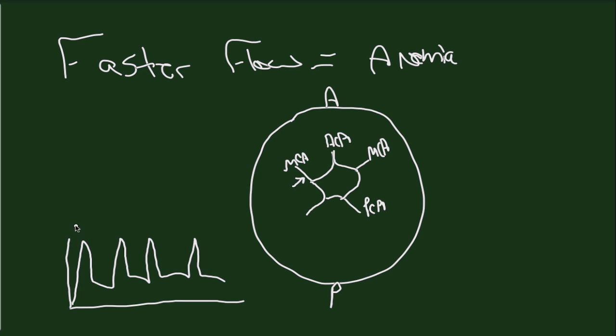This represents systole and this represents diastolic flow in the middle cerebral artery. What gets measured is the peak systolic velocity, which is represented by the peaks here and here and here. The risk of anemia is highest in fetuses with a peak systolic velocity of 1.5 multiples of the median or higher.